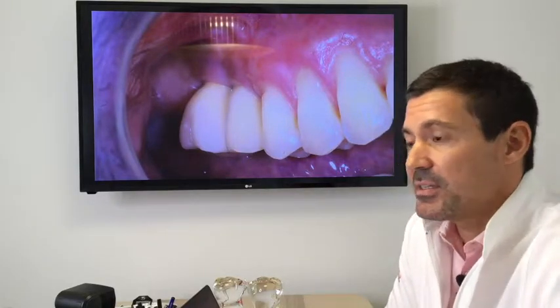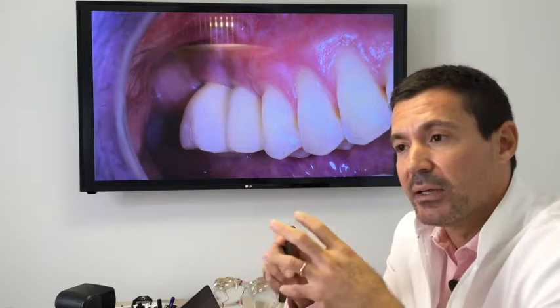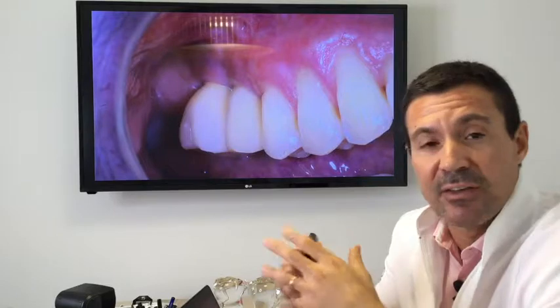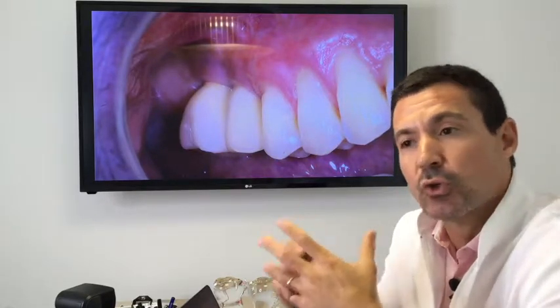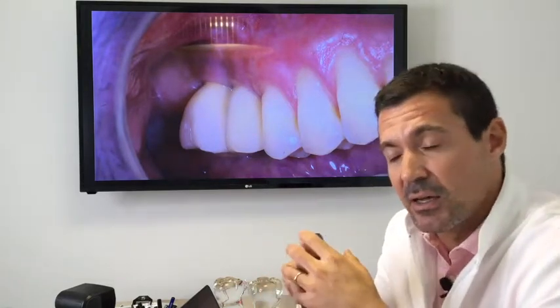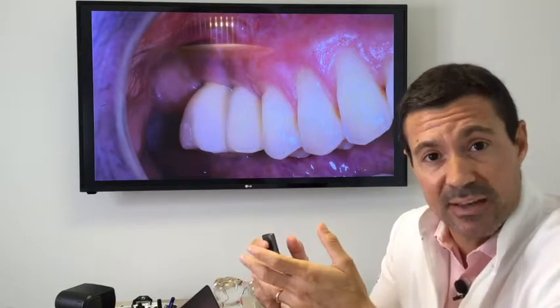As soon as I see a structure over implants that gets loose, it's important to check what the problem is. Not only diagnose the screw loosening as an event that may happen, because it's a screw that goes into an implant, or a screw that goes through a prosthetic abutment and then screws into the implant. We should try to focus on the cause of the problem. Most of the times, just like when the patient develops periimplantitis, the screw loosening or the structure that gets loose has a multifactorial effect.